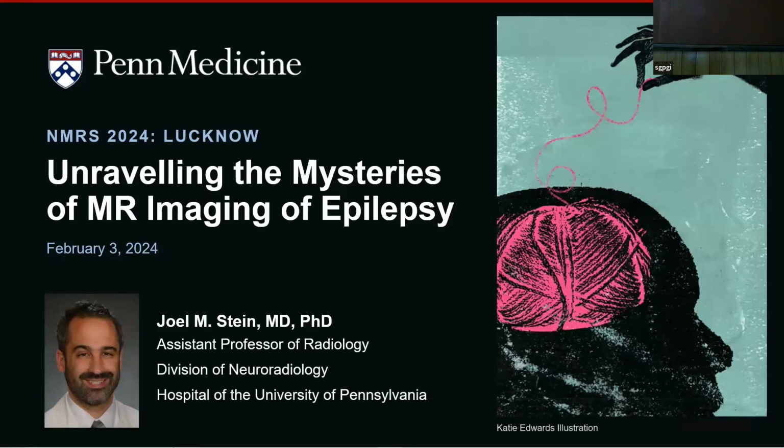I was given the title for my talk, so I can't take credit for it, but I love the idea of unraveling the mystery of MRI and the mystery of epilepsy using MRI. I found a very appropriate illustration on the right that evokes our process as we pull on the threads, tease apart, and untangle the structure and function of the brain through imaging to find that knot, that lesion that may be causing seizures.